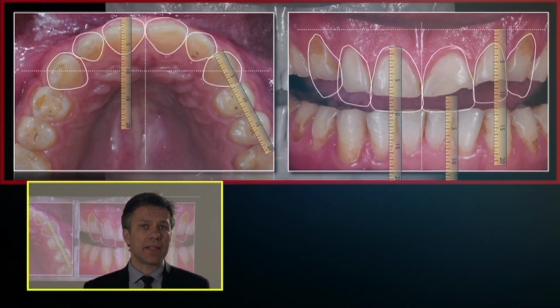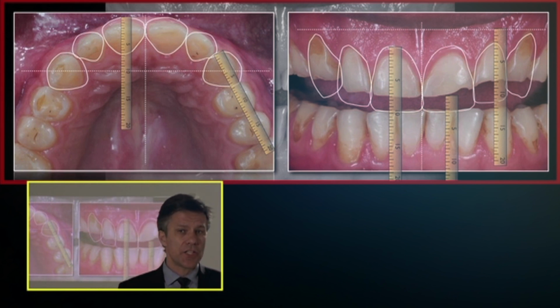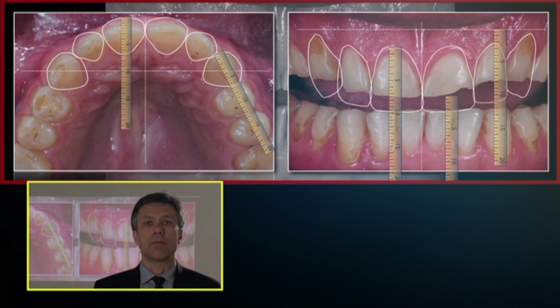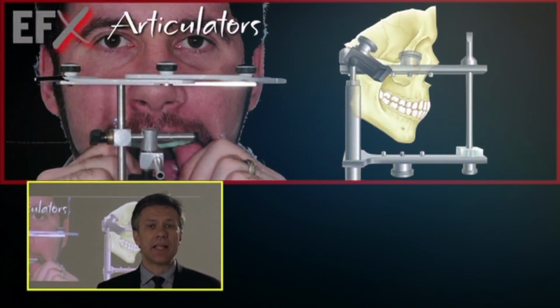Here we can determine how much we're going to increase. Of course, this is not definitive. This will be tested in the mouth. This is very important because I initially made some assumptions that I have to increase 2.5 millimeters, but it should be tested in the mouth. So I guided the technician.